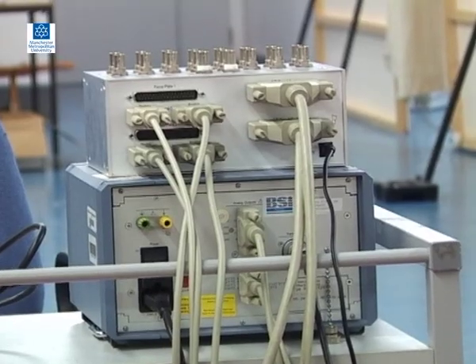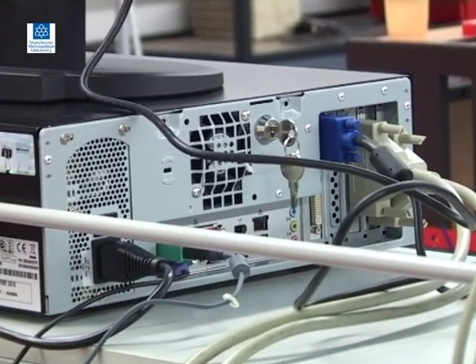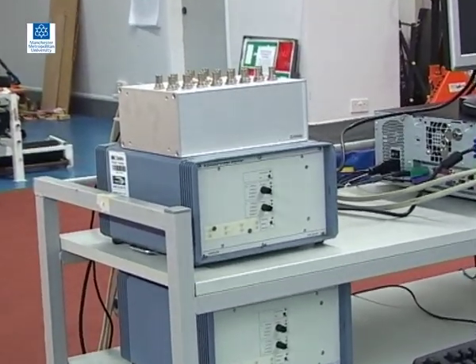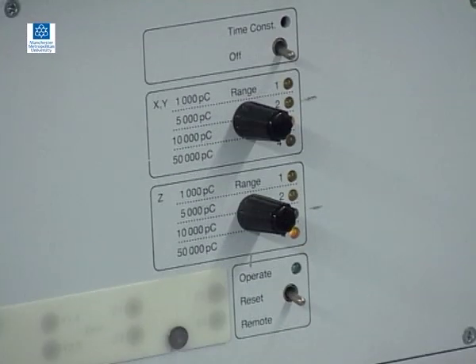A cable connects the amplifier to an analogue to digital converter in the PC. The AD converter converts the amplified force signal from analogue to digital. Force ranges on the amplifier can be set separately for the horizontal components Fy and Fx and for the vertical component Fz. It is important to set appropriate ranges depending on the activity being measured in order to maximise the resolution of the recorded force data. For example, a larger vertical force range would be required for somebody landing from a jump than for walking.